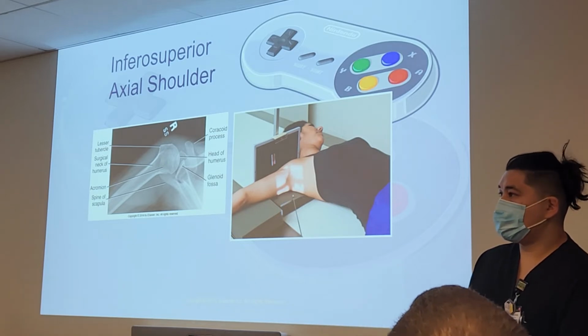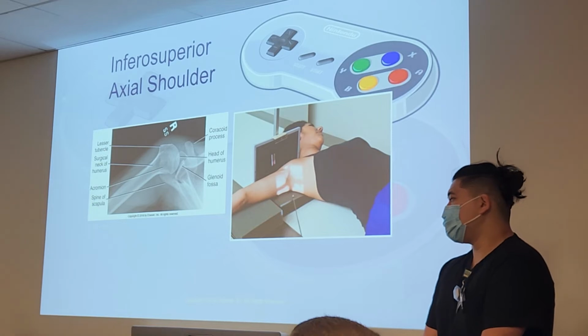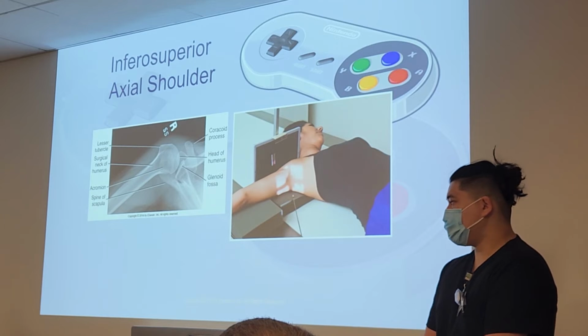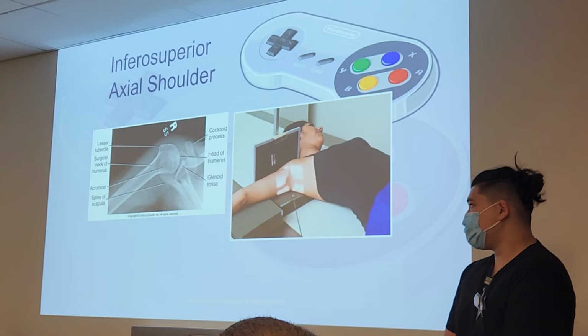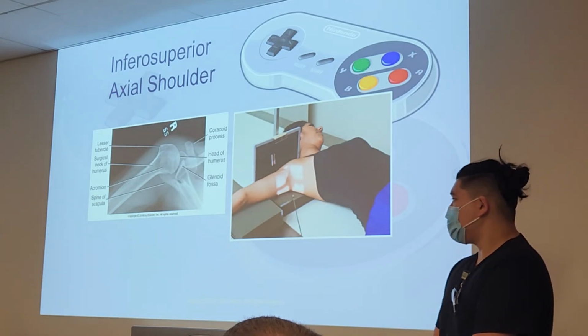Oh, okay. If you've seen those arthrograms at the hospital yet, the arthrograms are gonna inject contrast into those joint spaces. They'll do a shoulder just like this, and you'll see it light up that joint space specifically. A lot of people that go in with joint problems, they'll get those done to see if they're missing any fluid, if they need some kind of restoration to the joint.